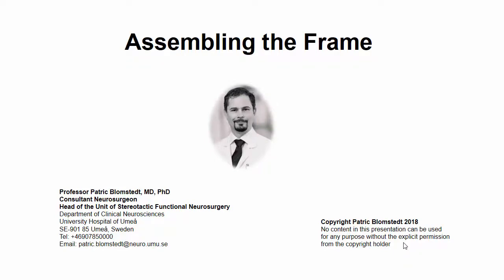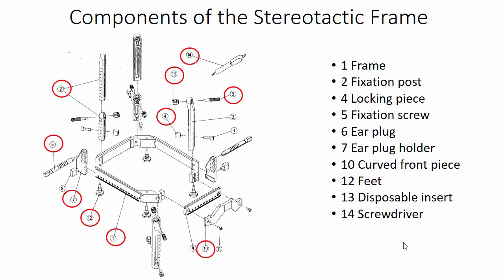Dear colleague, welcome to this lecture on how to assemble the stereotactic frame. Before we continue, it is advisable that you pause for a moment and make yourself acquainted with the components of the stereotactic frame, if you do not already know this.